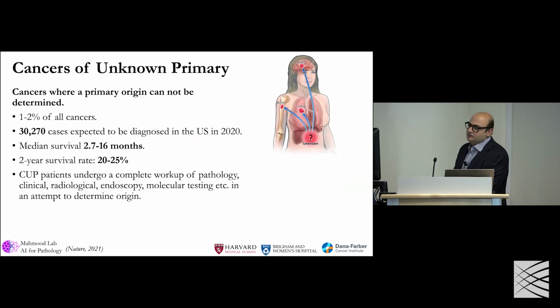So a number of different applications we targeted, we started this in 2019. I'll just say a little bit about those applications. So we looked into cancers of unknown primary. I think most people here are familiar, when cancer metastasizes, it often becomes unclear what the origin of the tumor might be, and most treatments are based off of the origin. So this is a critical problem.